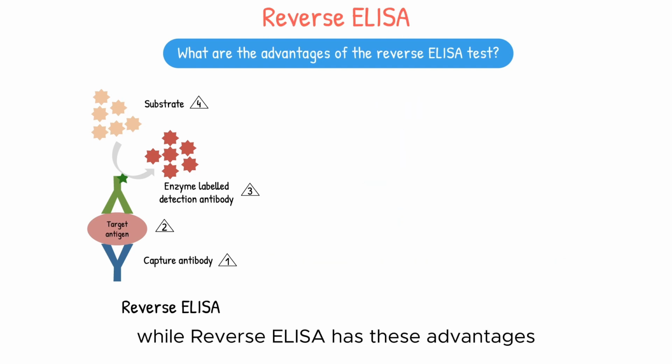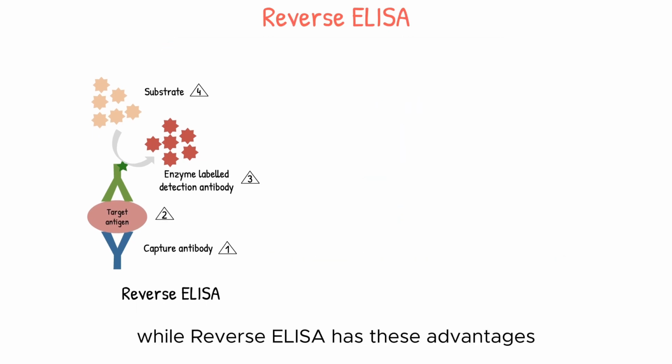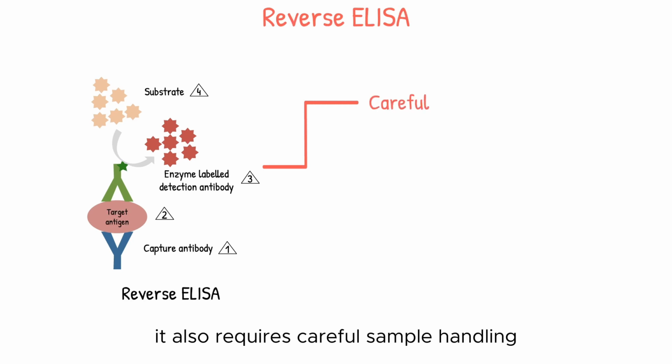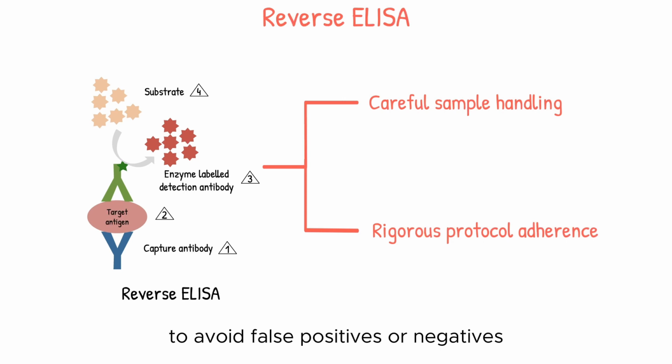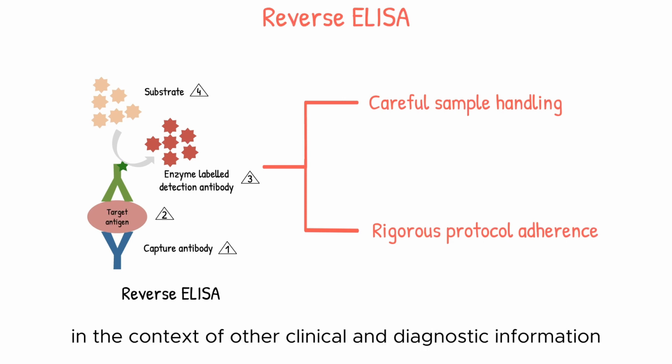Remember, while reverse ELISA has these advantages, it also requires careful sample handling and rigorous protocol adherence to avoid false positives or negatives. It's important to interpret the results in the context of other clinical and diagnostic information.